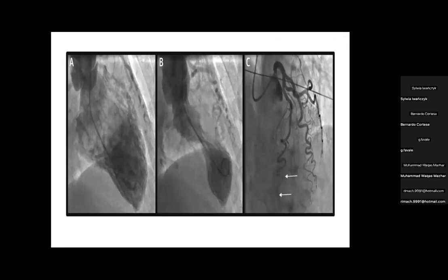Yeah, this is Vakas. Yes, it looks like something like an elongated heart, and there's a mid-cavity obstruction during the contraction of the LV cavity. And you see that all the coronaries lie in the same longitudinal plane. Something like a thin, lean image. Yeah, a thin, young patient.